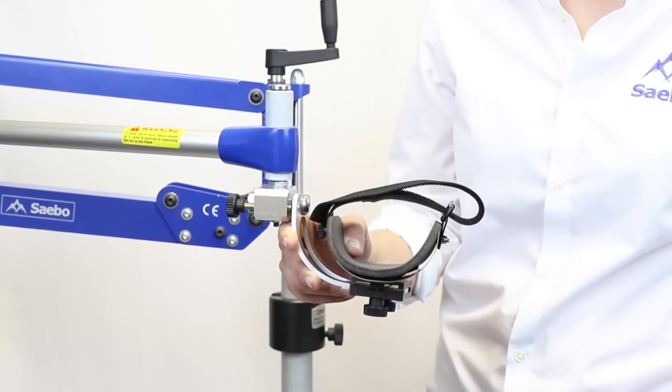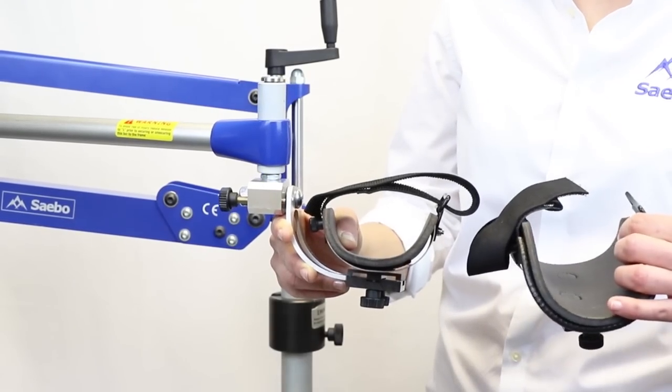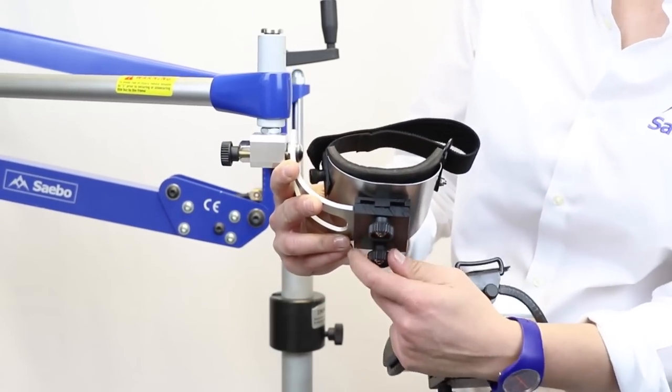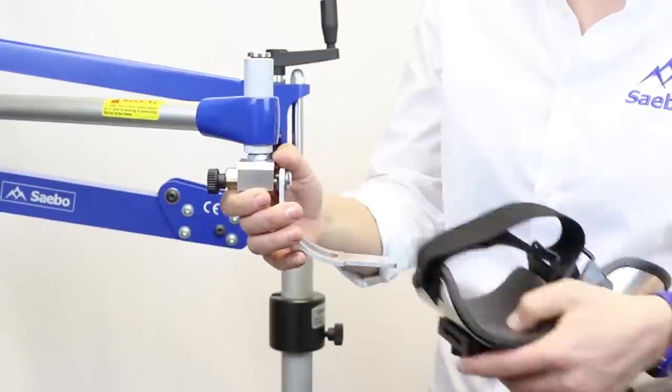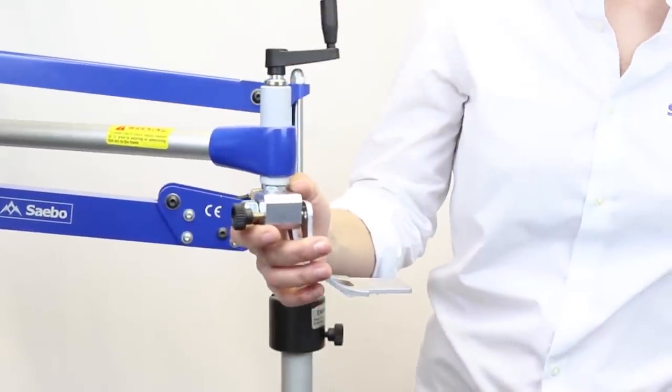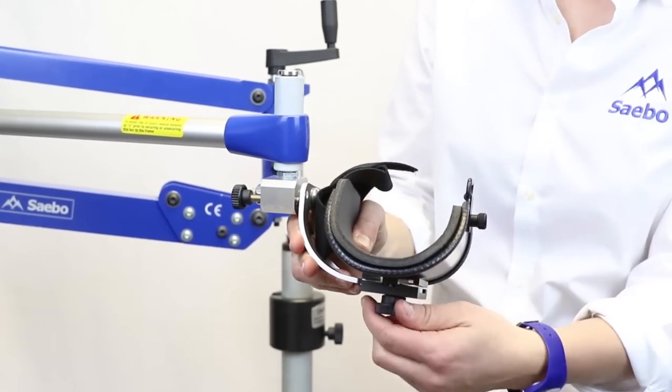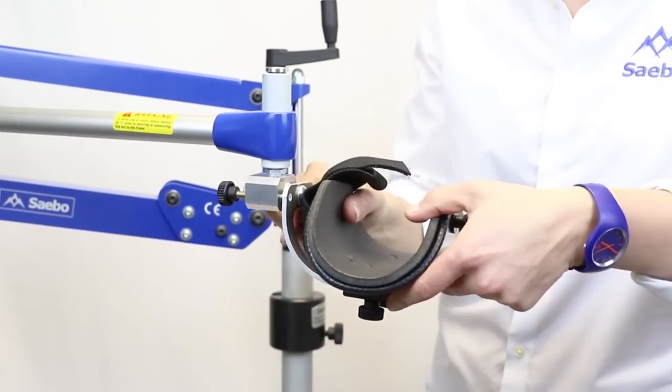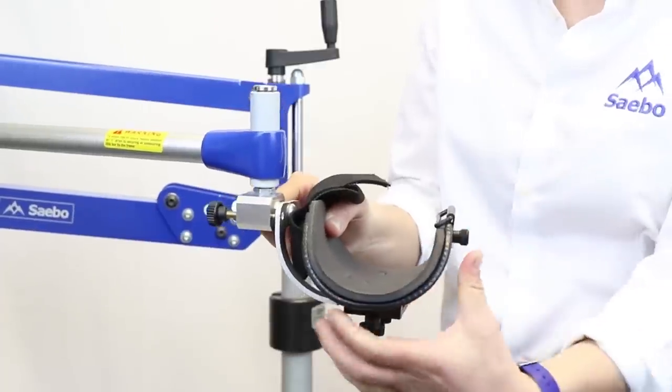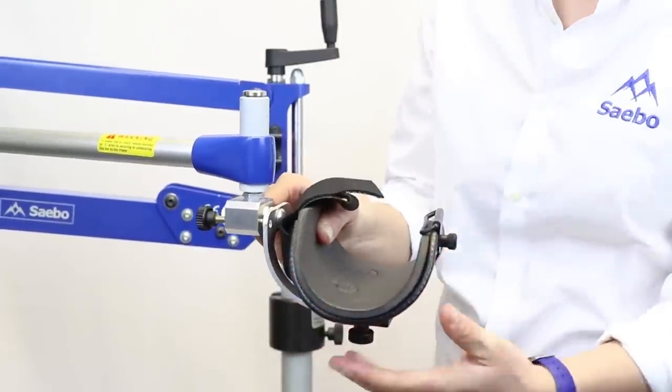We do have different forearm support sizes. So if you are combining the device with the Sabo Flex or your patient has a larger forearm you can swap over the size. The aluminium forearm supports are also malleable so you can adjust to the size of your patient's forearm.